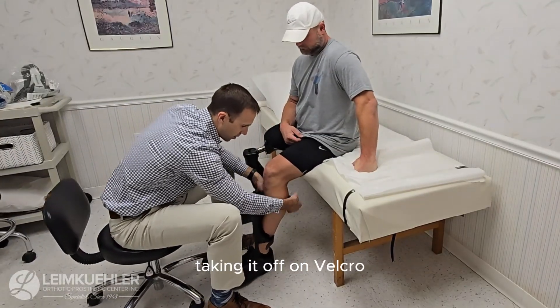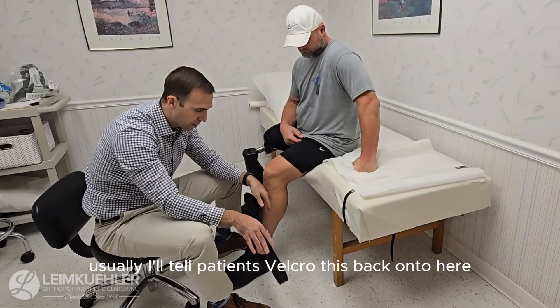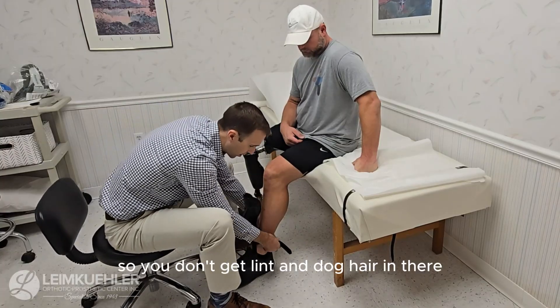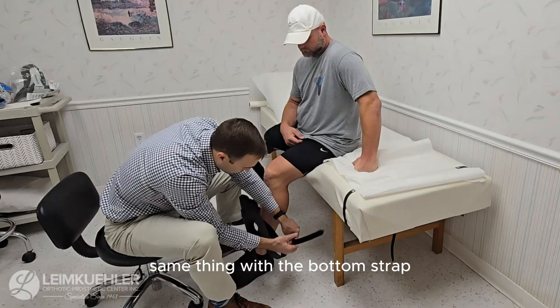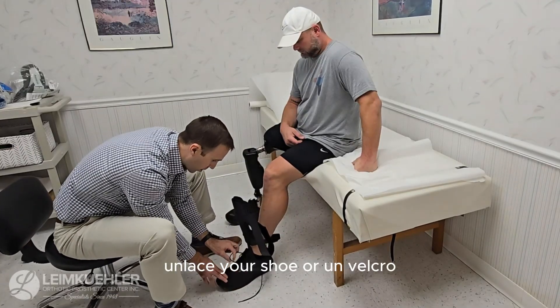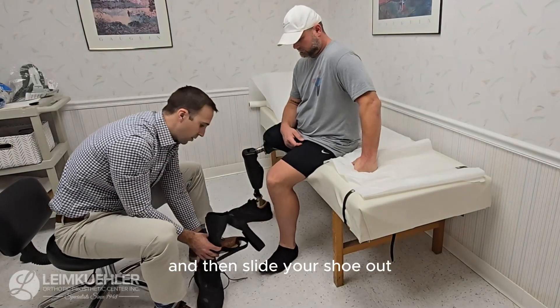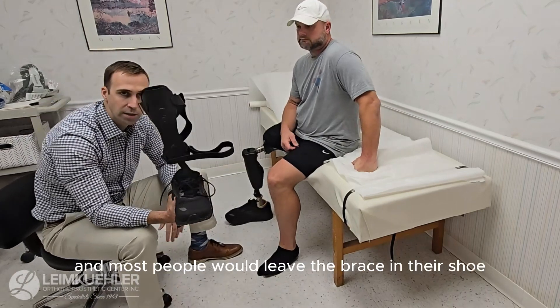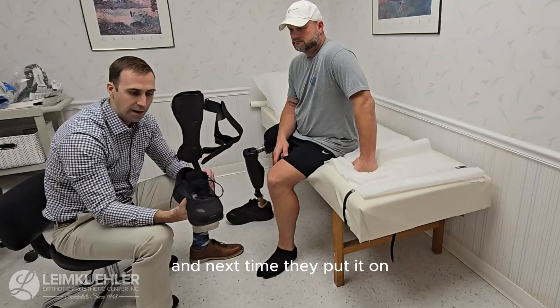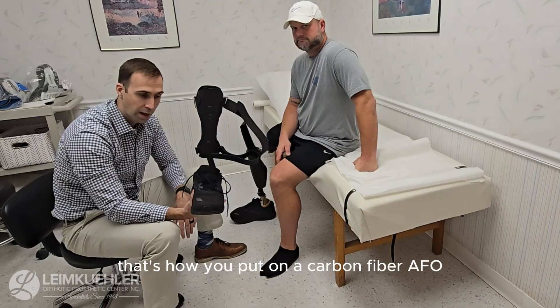Taking it off: undo the velcro. I usually tell patients to velcro the straps back onto themselves so they're not just hanging — keep it clean so you don't get lint and dog hair in there. Same thing with the bottom strap. Then unlace your shoe or undo the velcro, slide your shoe off, and put your foot out. Most people just leave the brace in their shoe like this, sitting inside of it. The next time they put it on, they just slide their foot in. That's how you put on a carbon fiber AFO.